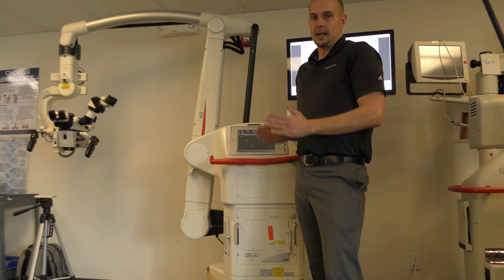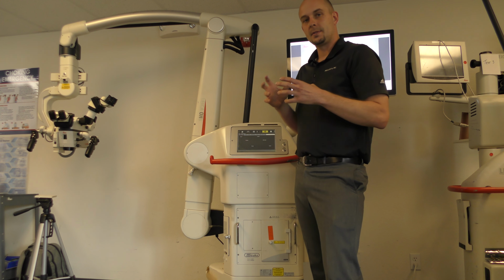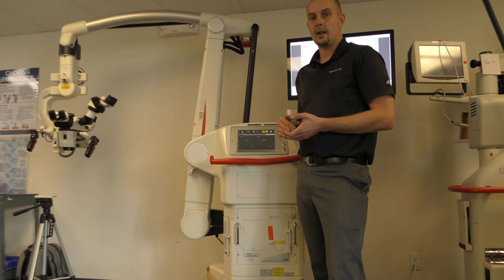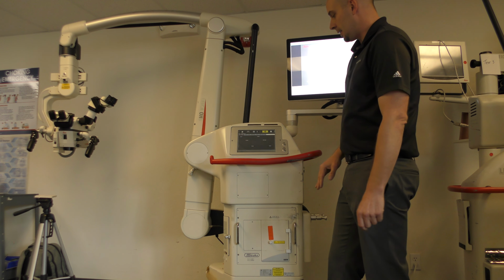You need to set your standard. Your standard is 500. The bulbs that we supply and the bulbs that OEM supplies are rated for 500 hours, and they have to be changed in that time frame. So just making sure that you do that.